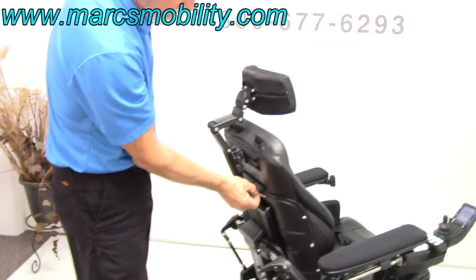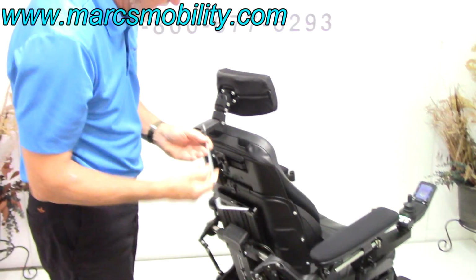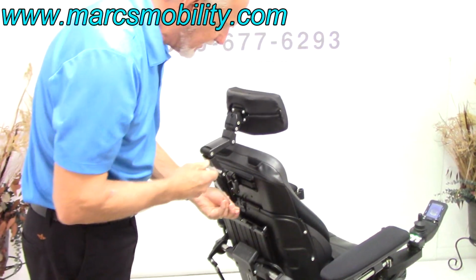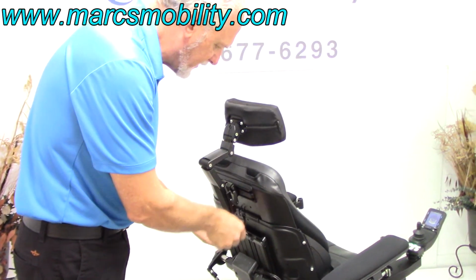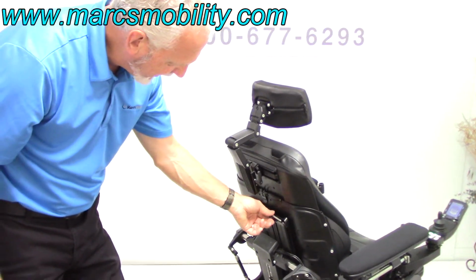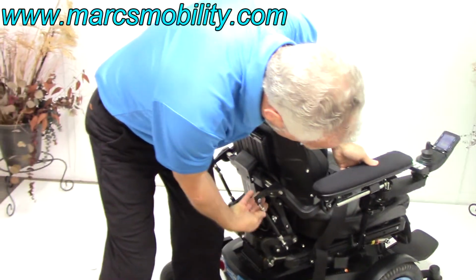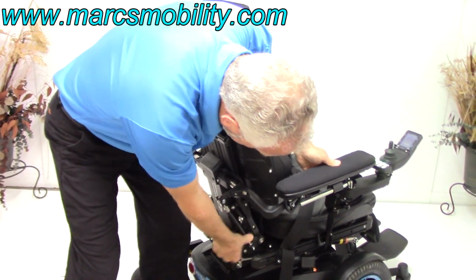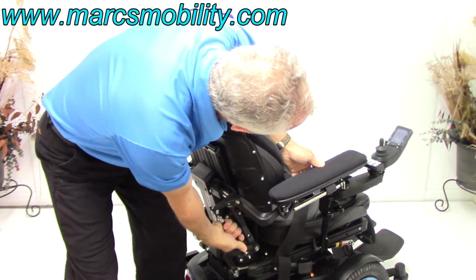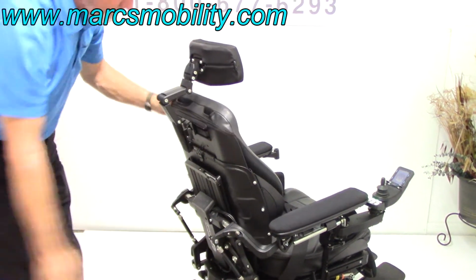You've got an adjustment wrench right here that you can use to adjust your arms. Any of these that'll fit in there, you can use this right here. It's included with your chair right here. So it sits right here. You got to know where it's at and you'll never find it. These pistons right here, if I turn them, I can adjust. If you unlock the white cylinders on the end, I can turn this and make the arm go up or go down. So you got one for each side to adjust the tilt of the arm.